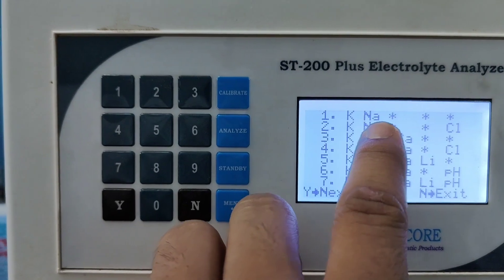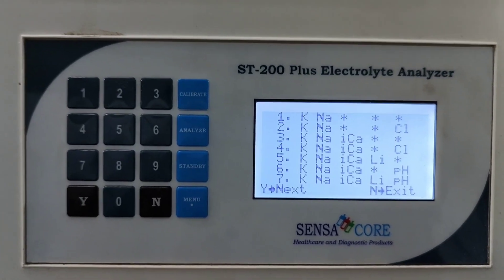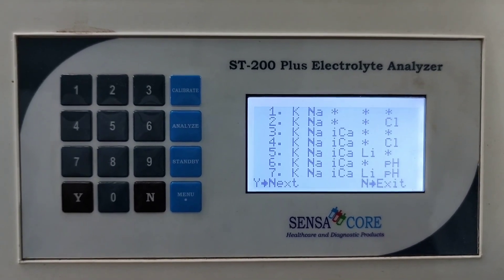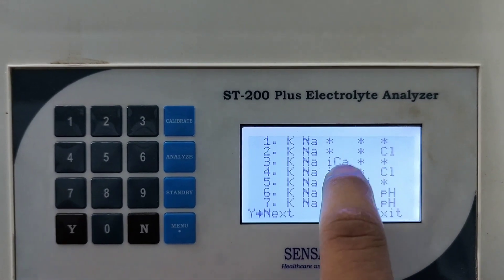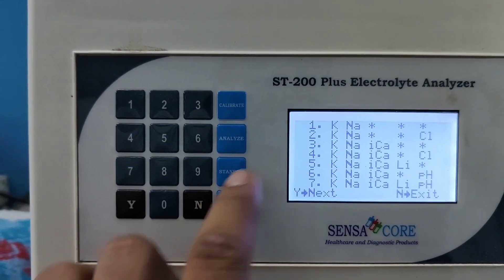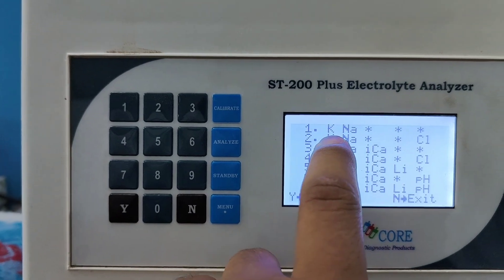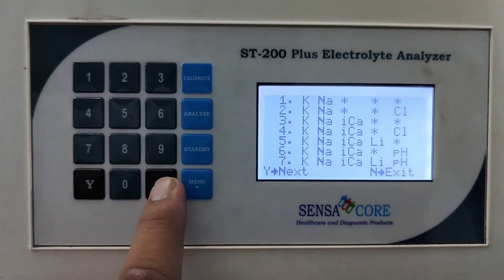If you want sodium potassium chloride, then press 2. If the electrode for ionized calcium is present, then you can also analyze ionized calcium present in serum. I am not selecting here because it is already selected in sodium potassium chloride mode.